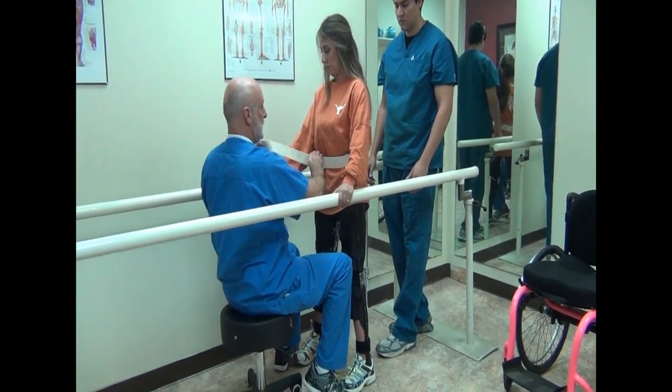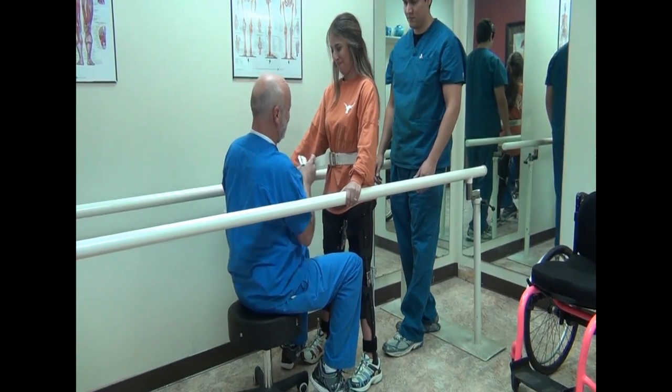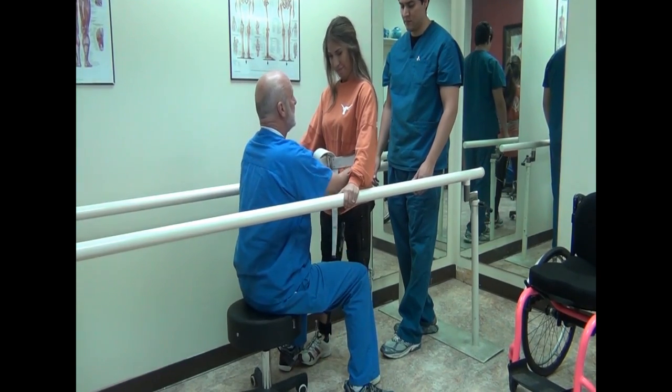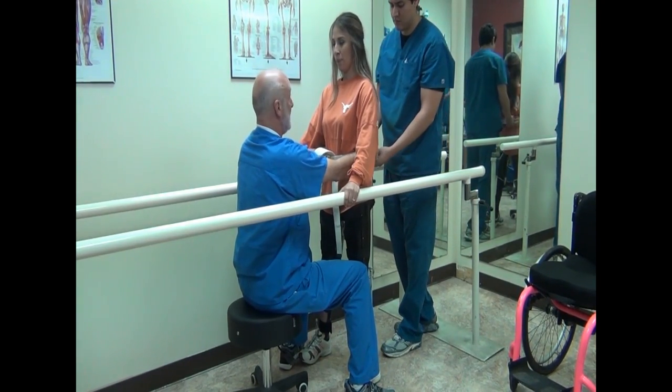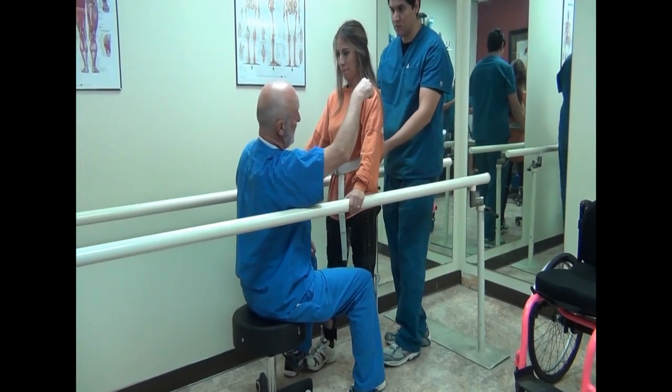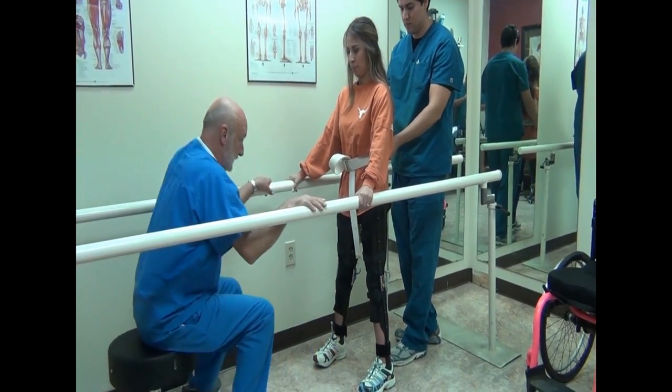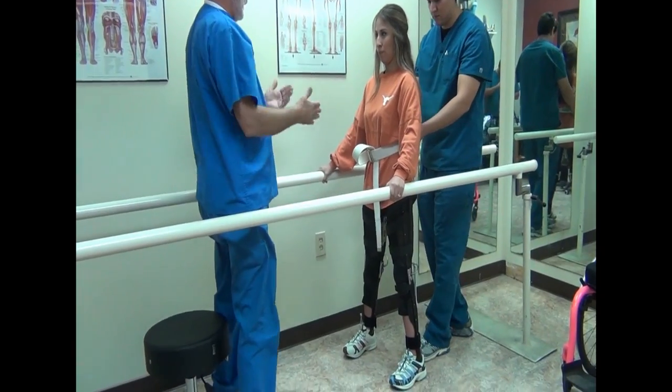This is a hanger belt — he's just going to hold on back here. In case you go down, he's going to make sure you go down safely. So kind of shift your pelvis forward, shift your weight over to one leg.